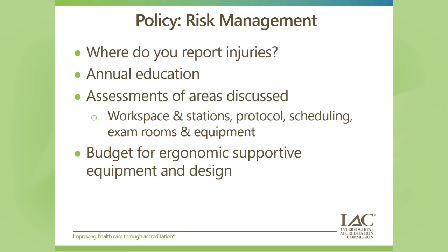Sometimes, whether it's through employee health or an ergonomics group, they can arrange for you to try out some of the things we've discussed as far as chairs and exam beds. They may have some contracts in place where they can do that. So ask if that is available before you make an investment in a piece of equipment, to ensure that most of your staff is going to like it and use it.